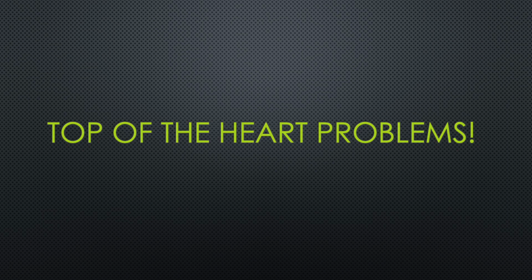And this is really important when you're doing these rhythm interpretations because you can tell where the problem is by seeing what is abnormal. So when we're talking about top of the heart problems, we're going to look at the P waves. If there's a top of the heart problem, or an atrial problem, there's going to be a problem in the P wave, because the P wave tells us if the top of the heart has squeezed. If there's a problem with the top of the heart squeezing, it's not doing its job, something's off. If something's off with the P wave, that's telling you it's an atrial rhythm. That can help you tell the difference between an atrial rhythm and a ventricular rhythm.